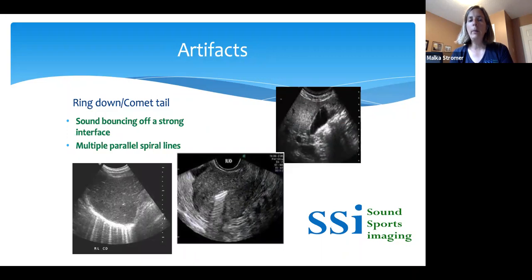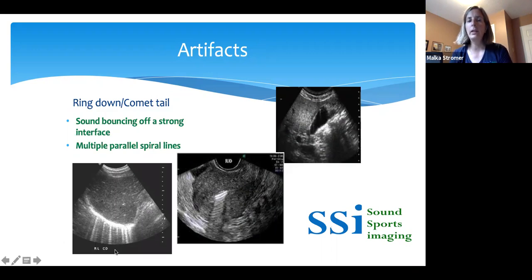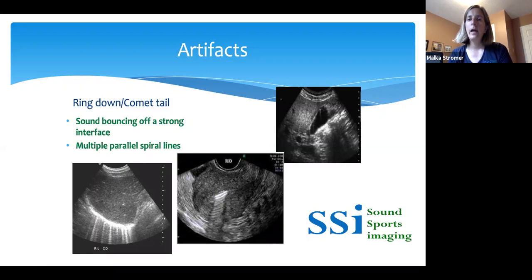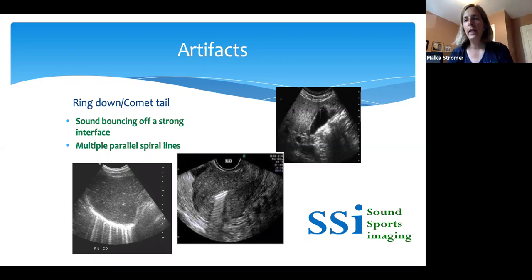The ring-down or comet-tail artifact, visible along the diaphragmatic surface, is associated with air in the lungs. We can get this air artifact — the ring-down comet-tail artifact — with multiple lines happening behind a bright echo, often associated with air. Other associations include metallic structures. This is an example of an IUD in the endometrial canal of a uterus, producing ring-down shadowing. There's also a ring-down or comet-tail artifact from a little cholesterol crystal in a Rokitansky-Aschoff sinus in somebody with adenomyomatosis. These artifacts are helpful to understand what tissue we're looking at.